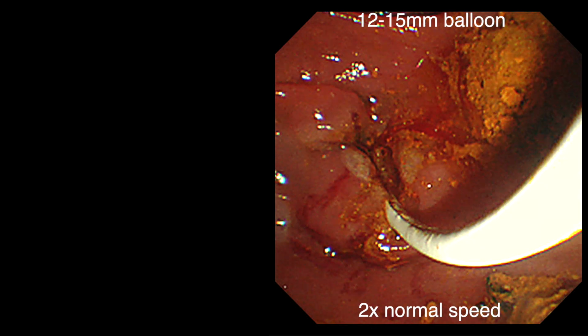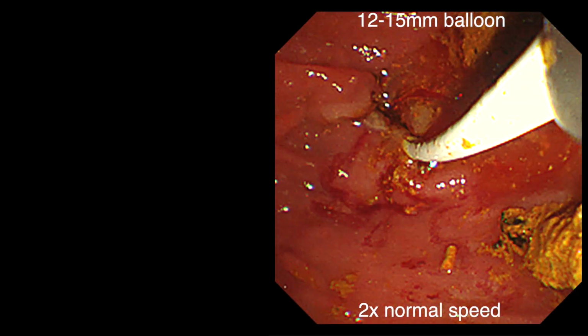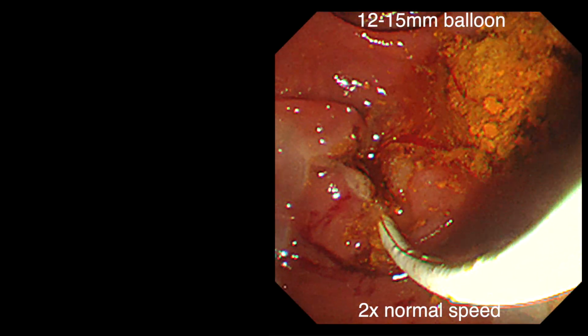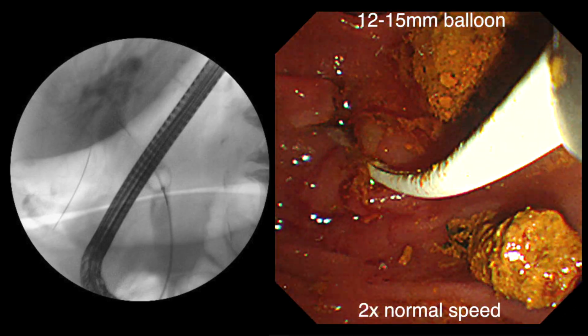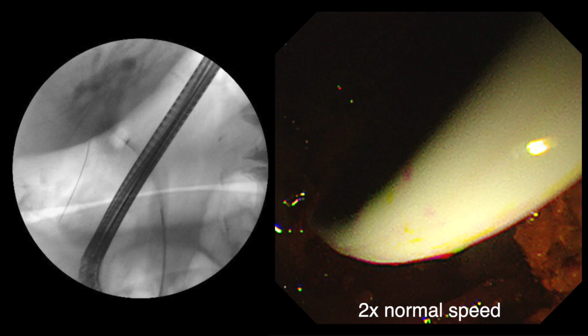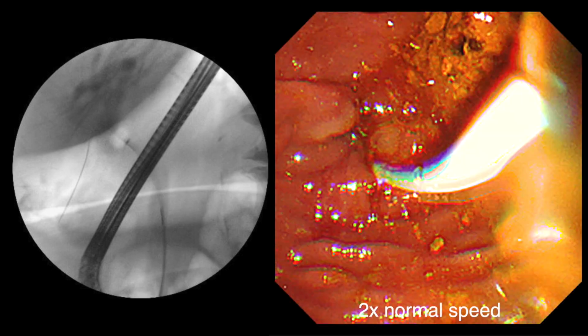Next, the stone fragments are extracted with a spherical balloon. We use a 12 to 15 mm balloon to trawl the bile ducts. With each sweep of the duct, some stone fragments are extracted. We continue to repeatedly sweep the ducts until no large pieces of stone emerge.